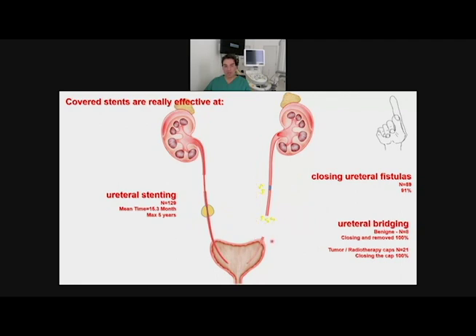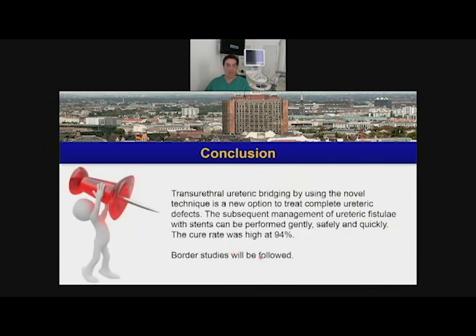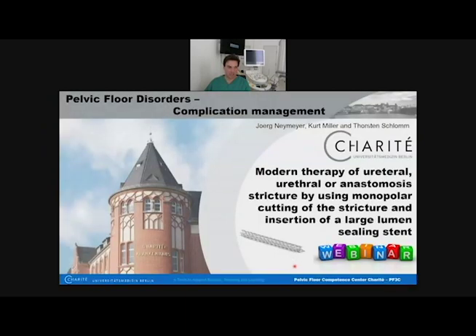If you have a cut only, before other treatments, in 100% it closes itself. In radiotherapy and after tumor extirpation, in horrible cases, the gap is closed in 100%. But in these cases, we leave the stent inside and then all is okay and we have no problem. The fistula closing rate is high and it's simple to do, and it saves our life, because these cases come every time on Friday when you want to go to your family and the gynae or the surgeon goes home.